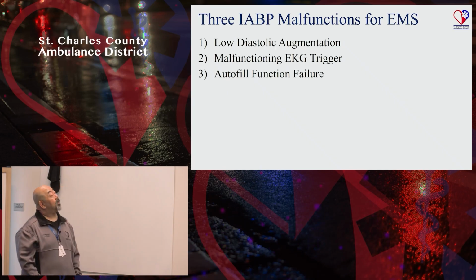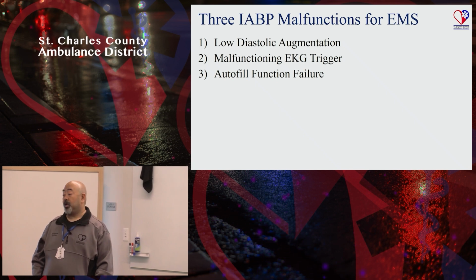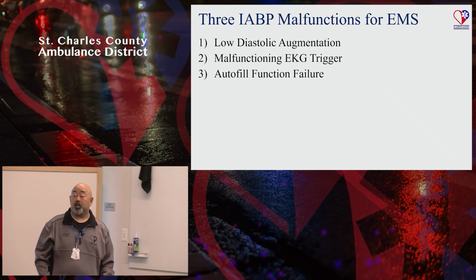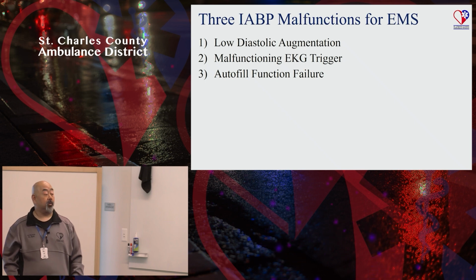So there are lots of alarms on these things. The three that I just wanted to review very quickly are probably the more common ones that you're going to see. One is a low diastolic augmentation alarm. The second is a malfunctioning trigger alarm. And the third one is an autofill failure. So let's look at the first one real quick.